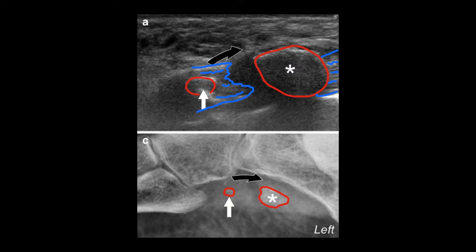This image shows us a peroneus brevis tear. You can see and confirm that with the discontinuity of the echogenic fibrillar fibers of the peroneus brevis.